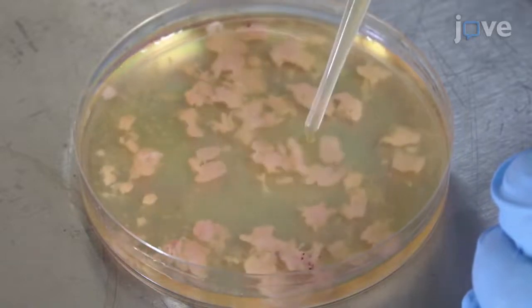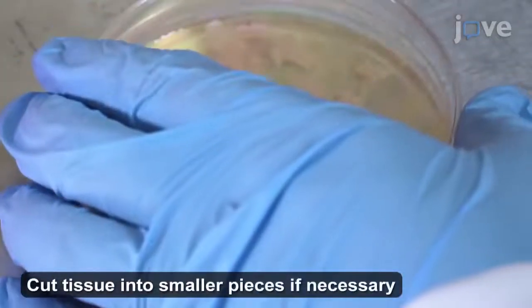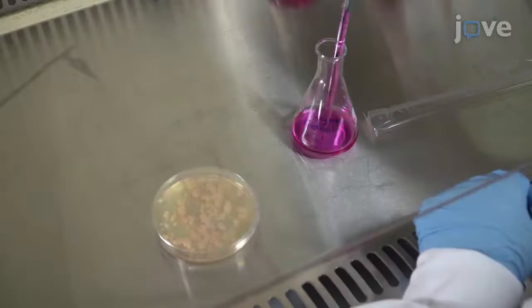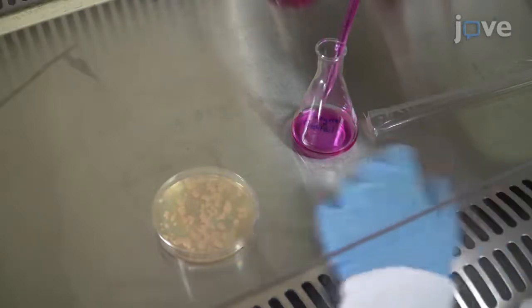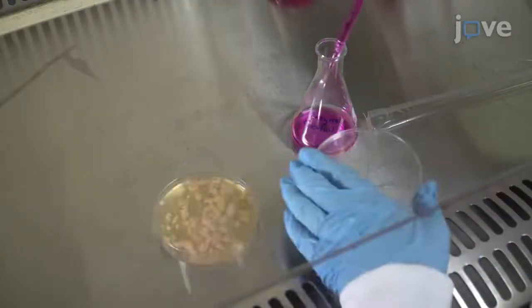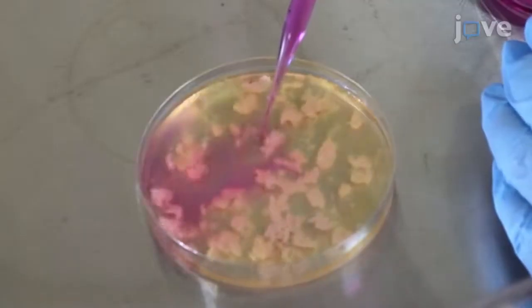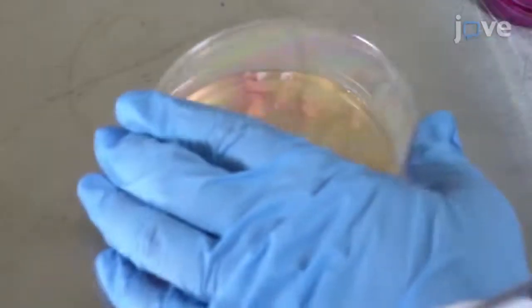After this, use a sterile Pasteur pipette to repeatedly aspirate the mixture to encourage disintegration of the tissue. Add another five milliliters of 1x collagenase D solution to the tissue and incubate it at 37 degrees Celsius with periodic gentle agitation for another 30 minutes.